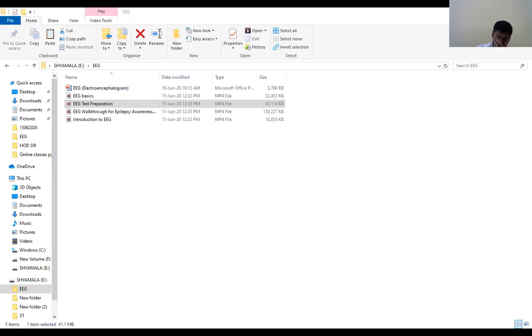your eyelids. If we do obtain a positive response in the form of a jerk or twitch, the light will be turned off immediately. Another activation procedure we use is hyperventilation, or a deep breathing exercise. If you have any history of heart or breathing difficulties, we may omit this portion. We simply ask you to take faster and deeper breaths for 3 to 5 minutes, blowing in and out through your mouth.